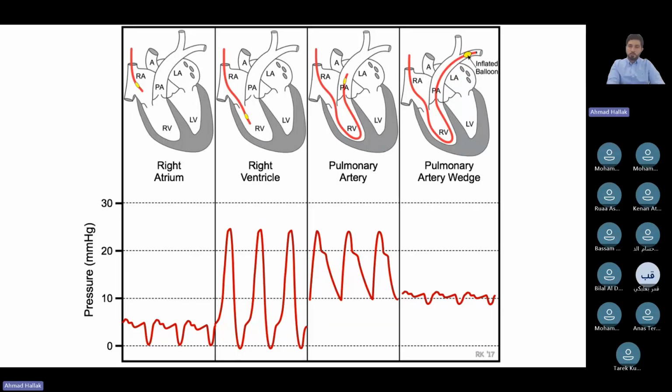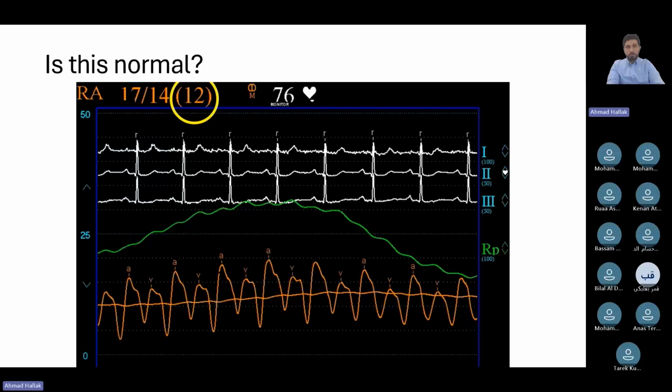Especially in patients with severe pulmonary hypertension, it gets harder to float it. So next is the wedge pressure. If you're at 70 centimeters and you haven't wedged it, then you're probably not going to wedge it. You're probably coiling in the RV or coiling somewhere else.